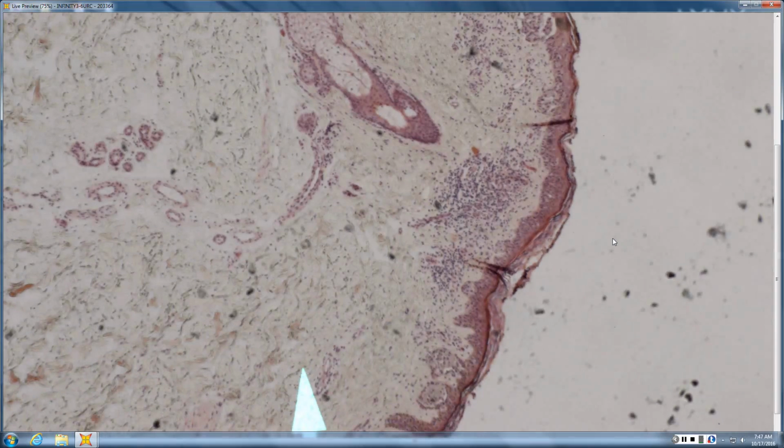What's the buzzword for cryoglobulins filling the vessels? Doesn't it look like something special? Jello jigglers. Okay. Usually no vasculitis. So mixed cryoglobulinemia looks just like a postcapillary venular leukocytoclastic vasculitis. Monoclonal cryoglobulins are jello-like deposits in the vessel in the absence of vasculitis.